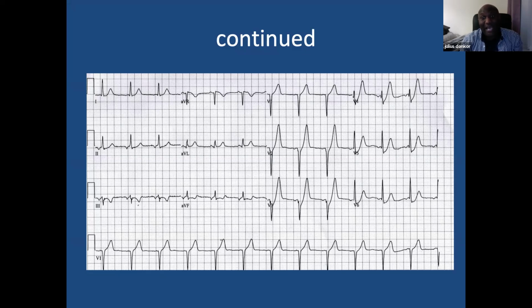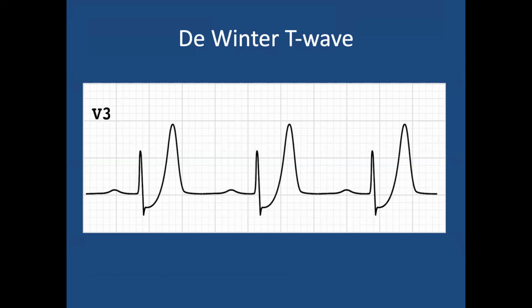That is an emergent MI that you need to act on before it becomes full-blown proximal LAD occlusion within hours. So a lot of people do miss that. A lot of people do. Thank you. That's a very good one.